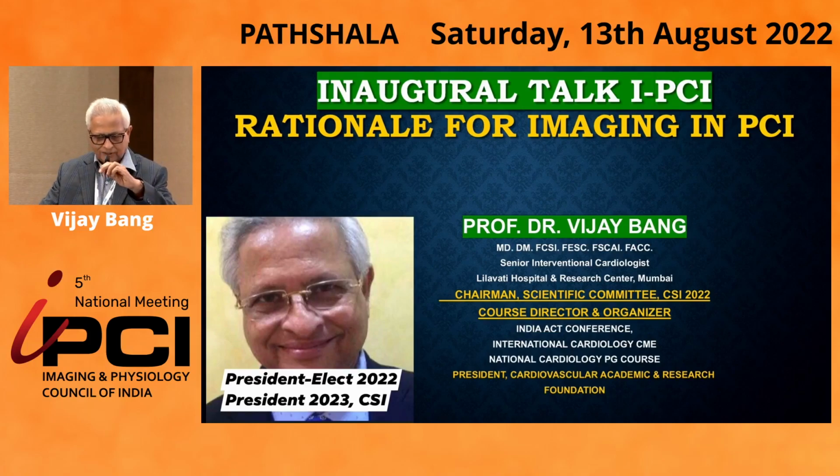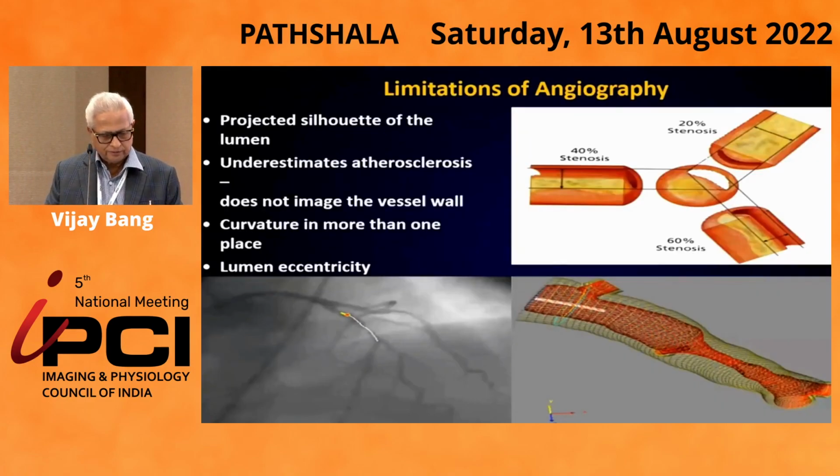This is my inaugural talk on a very basic topic: the rationale for imaging in PCI. We all know that our standard tool for imaging coronary is coronary angiography. It has several limitations, we know. Coronary is a three-dimensional structure, and we image two dimensions on coronary angiography.